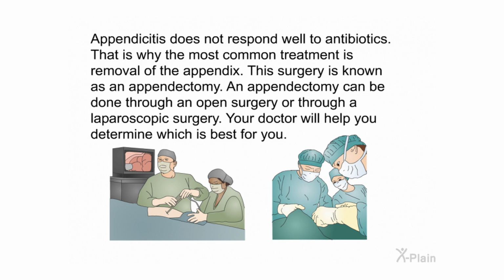Appendicitis does not respond well to antibiotics. That is why the most common treatment is removal of the appendix. This surgery is known as an appendectomy. An appendectomy can be done through an open surgery or through a laparoscopic surgery. Your doctor will help you determine which is best for you.